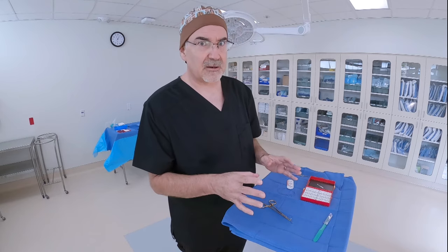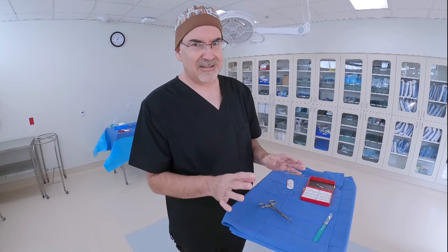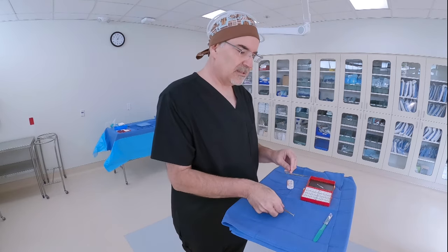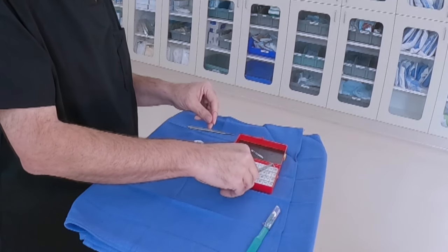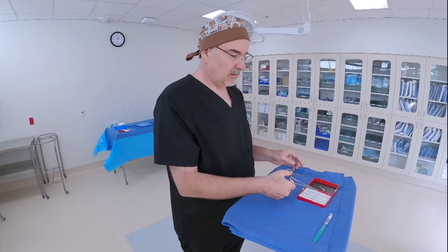As soon as you receive the needle back from the surgeon — assuming the surgeon is not going to use this particular needle again, which is rare — take the needle and place it into your needle book, into one of the numbered spots on the foam. These numbers will help you count your needles at the end of the case.